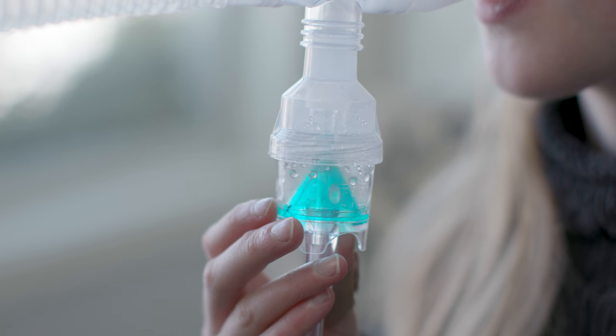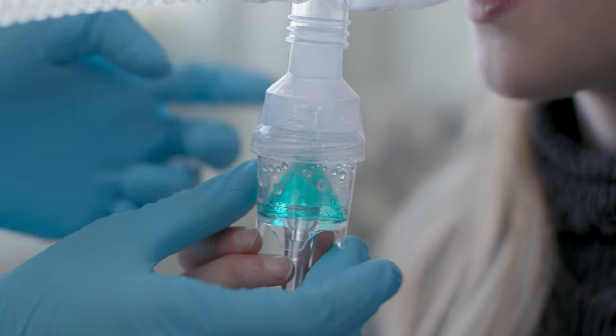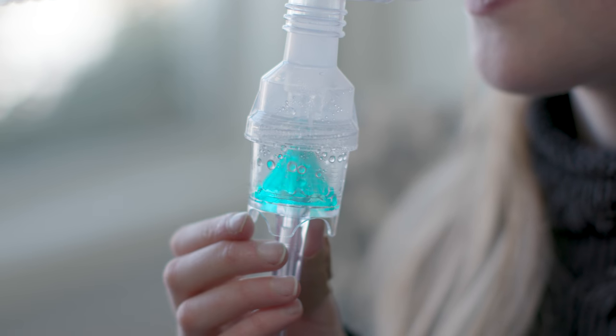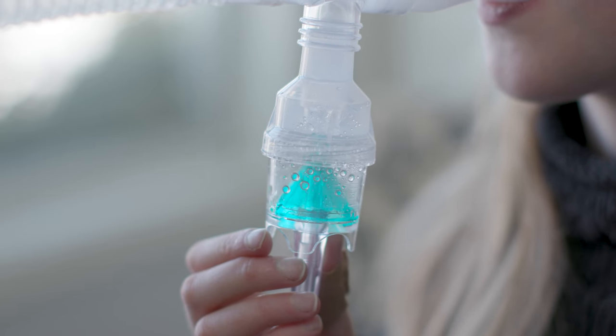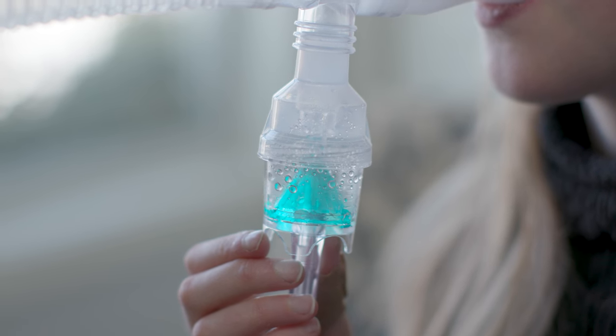Always keep the neb cup as upright as possible during the neb treatment. Gently tap the cup every 2 to 3 minutes during the treatment to move droplets of medicine to the bottom of the cup. This ensures the patient receives all the medicine.